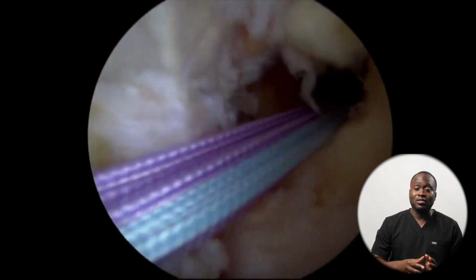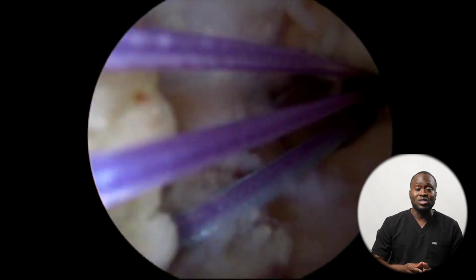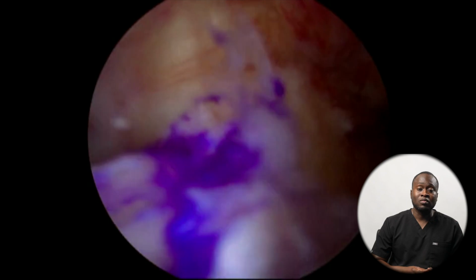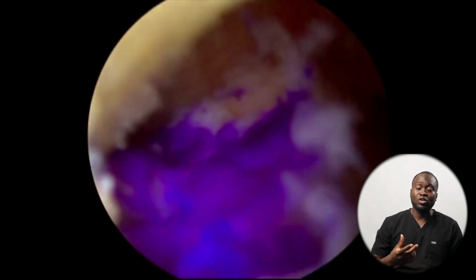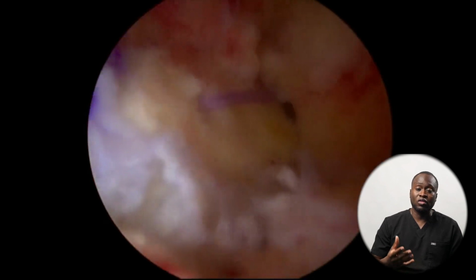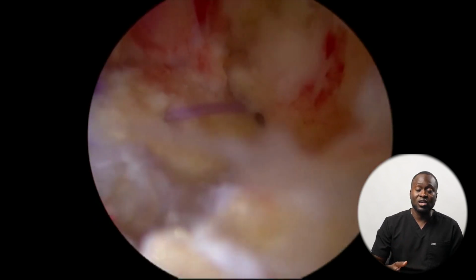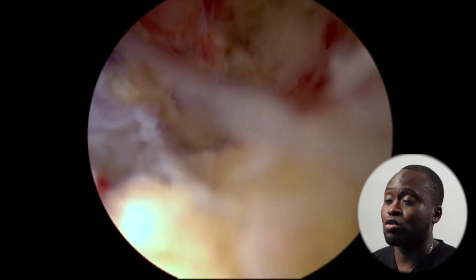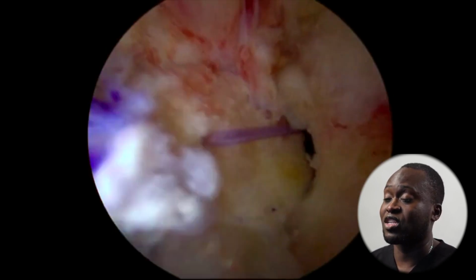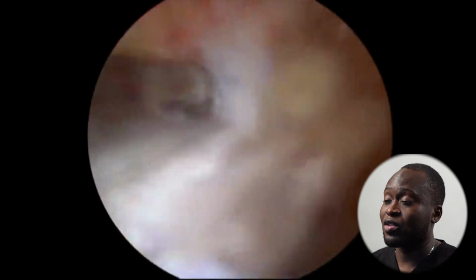Now, that graft, that new ACL, like we said, can be taken from a variety of places. In this specific situation, it was taken from a patella tendon. And when we do that, we frequently take bone from both the patella and from the tibia, the shin, and make that part of the graft. And what makes that a strong graft is that you can get bone to bone healing once that graft has passed through.